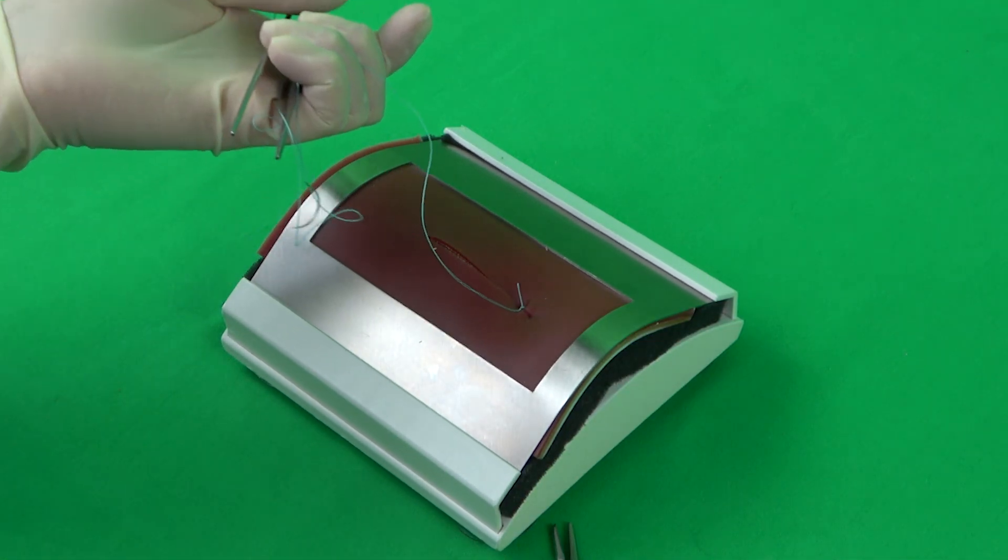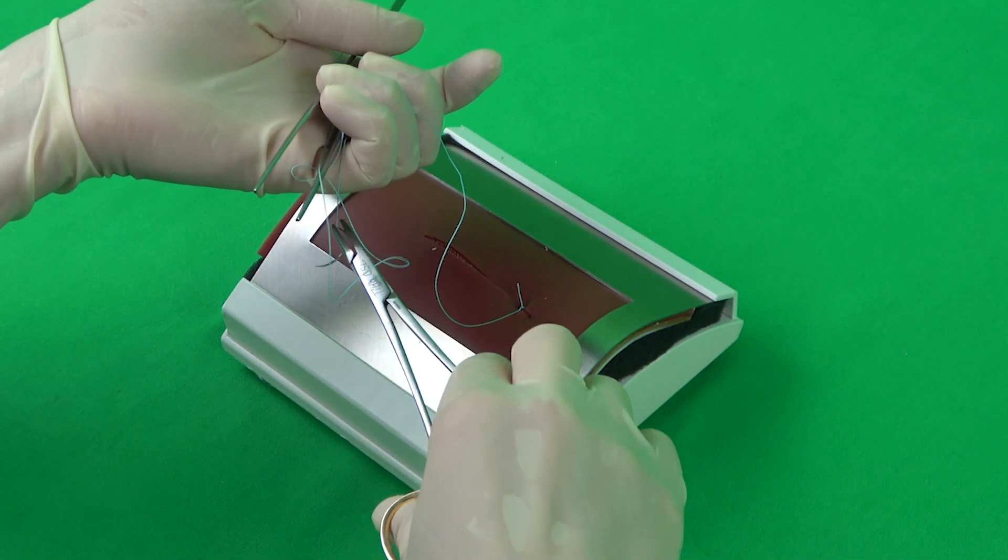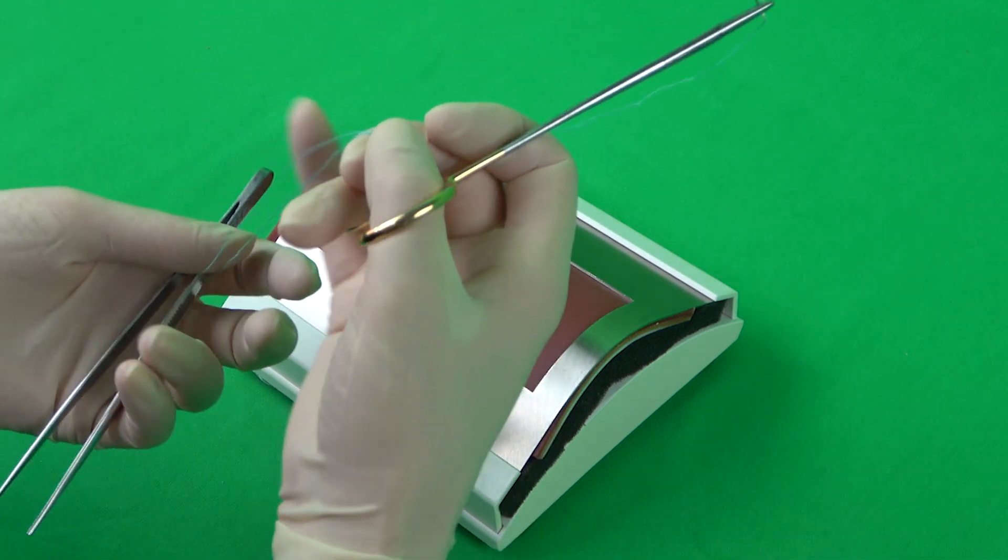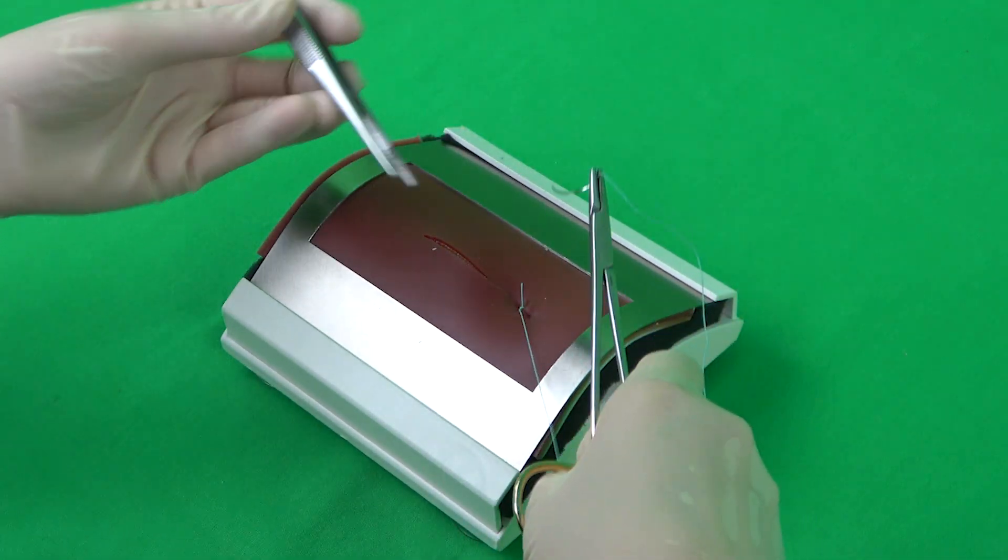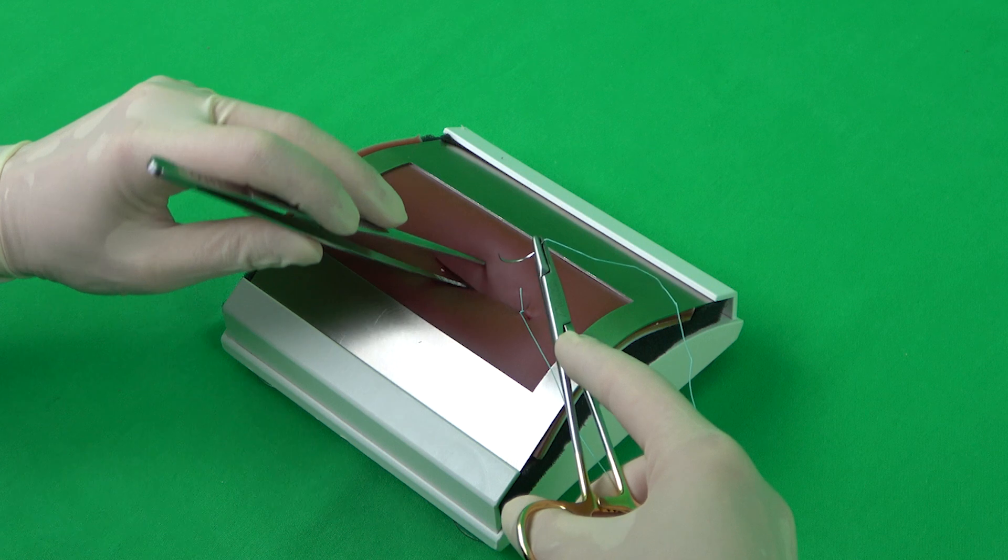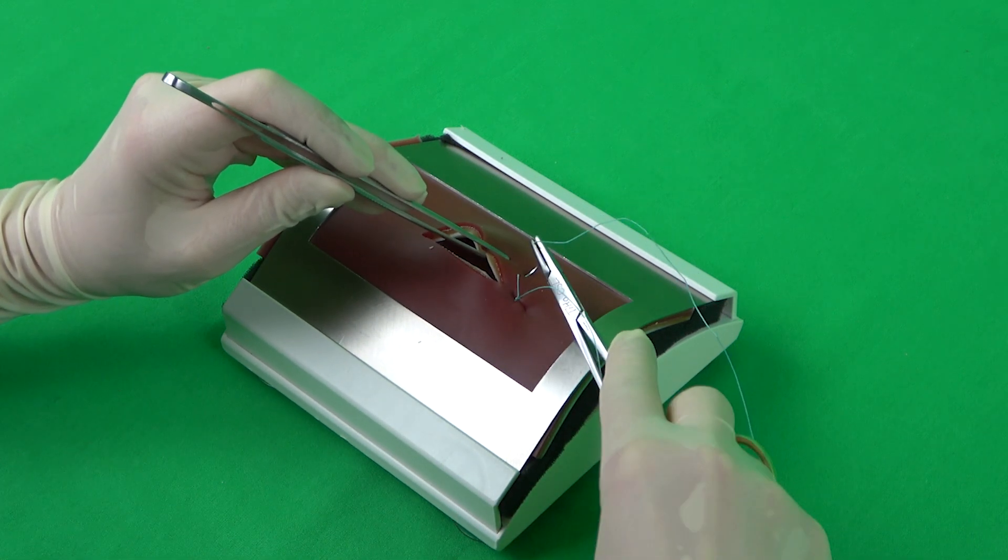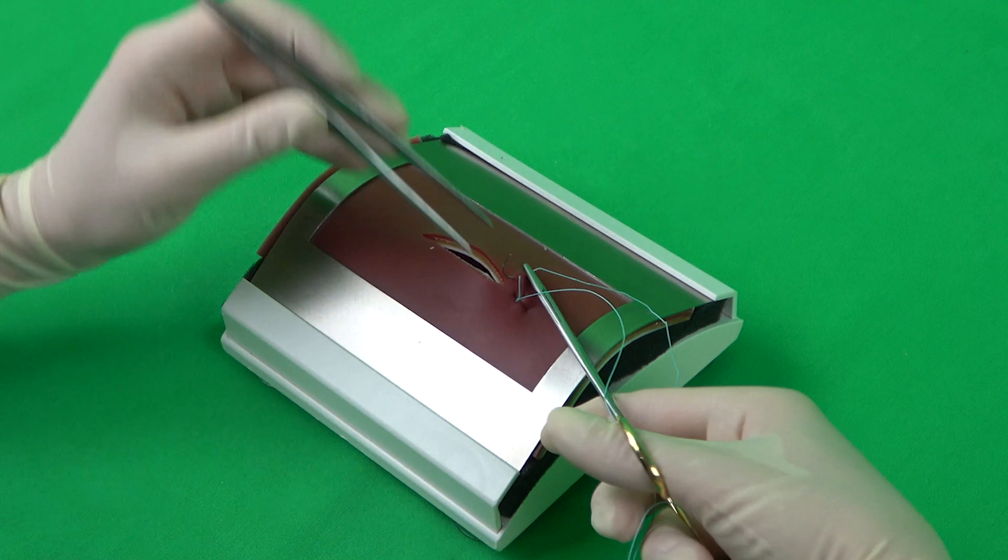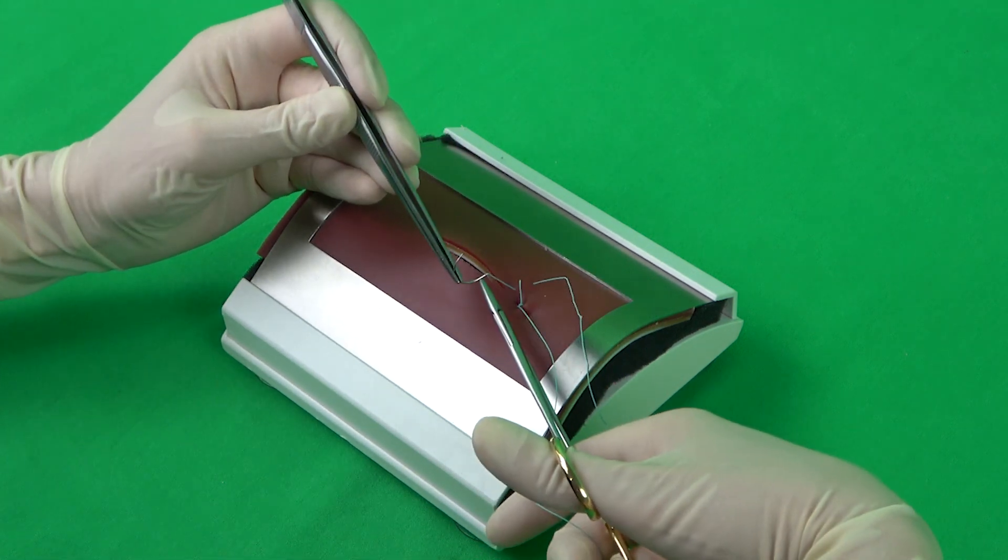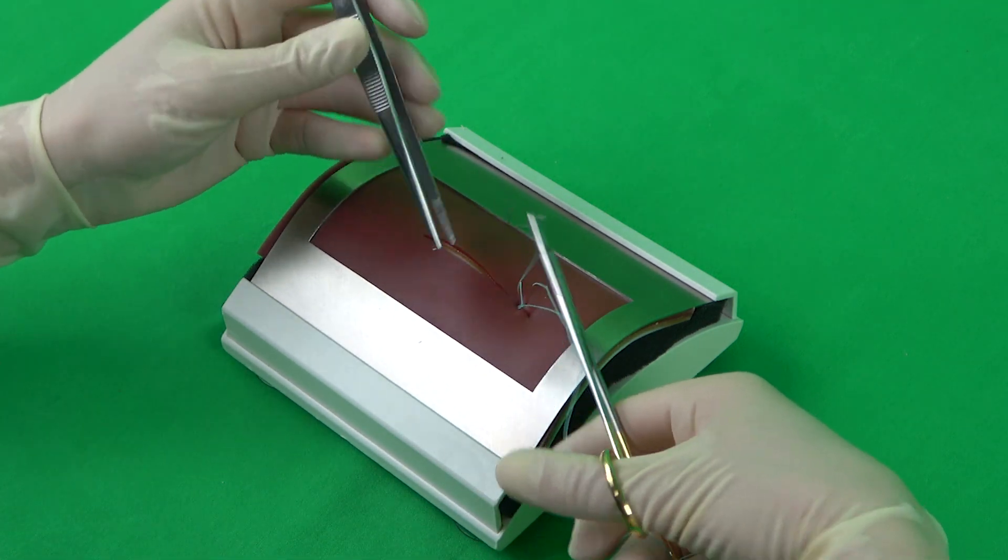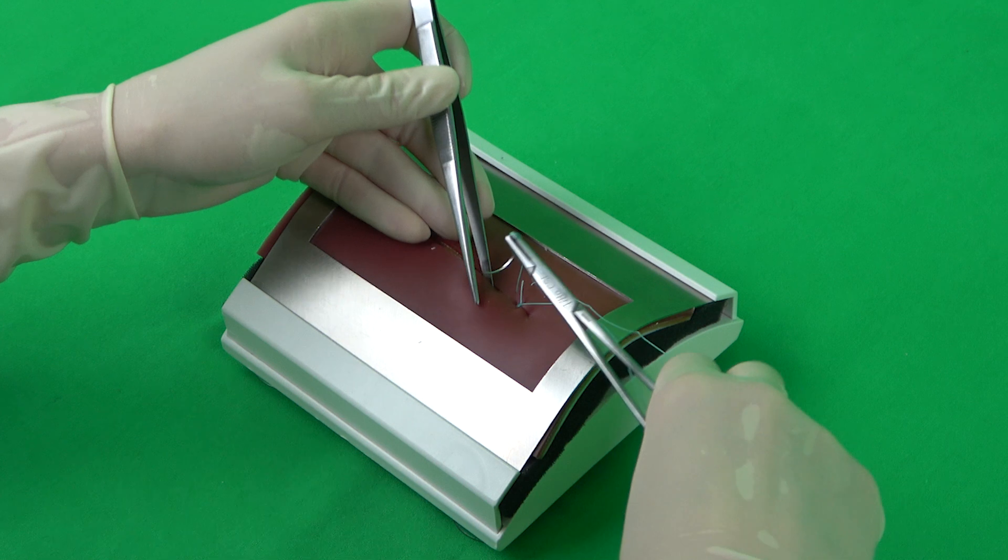The following suture pattern lies perpendicular to the wound gap, alternating on either side of the wound. The edge of the wound is grasped with forceps, lifted, and the needle is driven through the outside of the tissue, allowing it to exit on the same side. This procedure is continued on the opposite side, parallel to the first stitch.